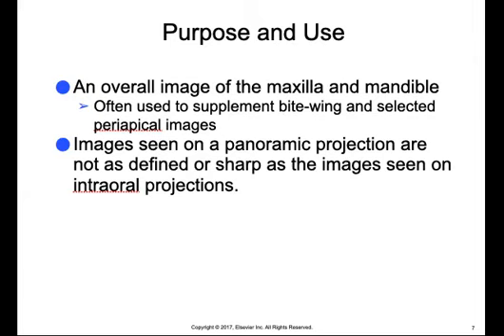They can be used to evaluate impacted teeth and supporting structures of the dentition. They can evaluate eruption patterns and growth patterns. They can detect lesions, diseases, and conditions of the jaws, and they can evaluate trauma.